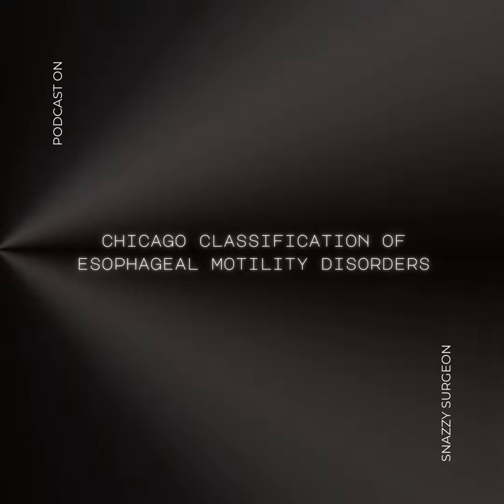All right, let's talk about achalasia now. We're all pretty familiar with this one. How does the Chicago classification define it? So achalasia also has that elevated median IRP over 15 mmHg. It means the LES isn't relaxing the way it should. But the crucial difference here is that there's also no normal peristalsis in the esophageal body. And to make things even more specific, the Chicago classification actually breaks down achalasia into 3 subtypes based on the different patterns we see on HRM.